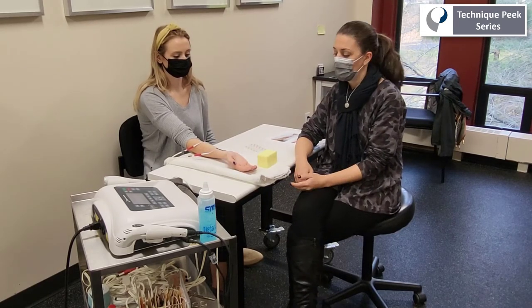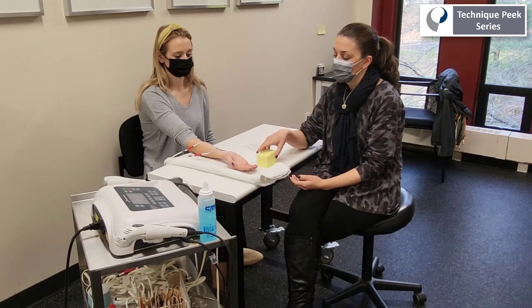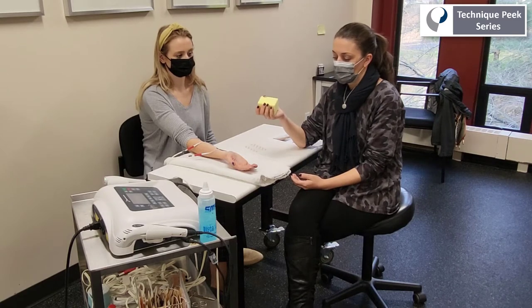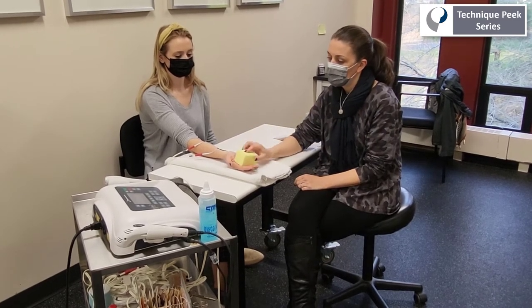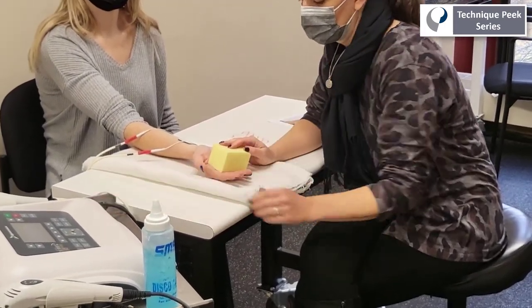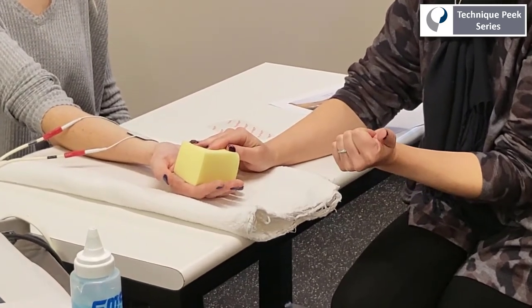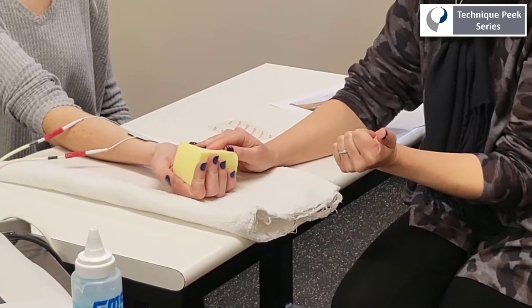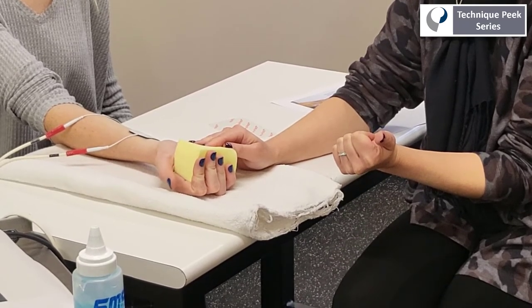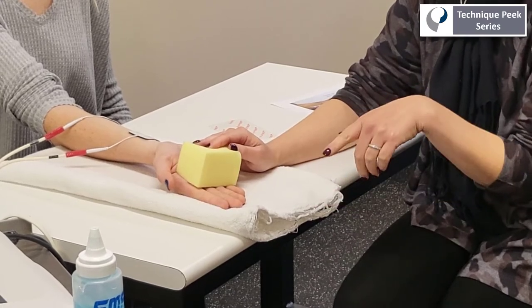In this example, we're going to give the patient a sponge to hold. While the machine is providing the stimulation, the patient is also going to attempt active finger flexion, specifically a flat fist position. During the active contraction, the patient is attempting the flat fist position and holding the sponge while receiving the stimulation. During the rest period, the patient will rest the finger flexors to avoid excessive muscle fatigue.